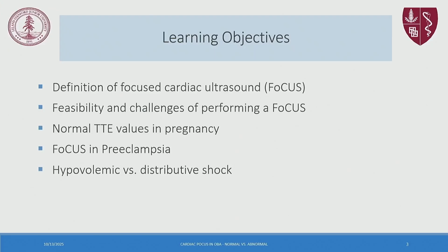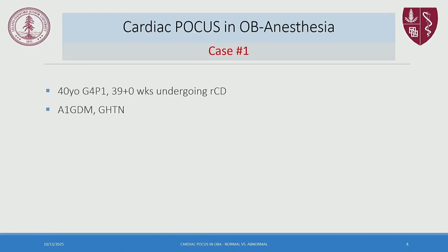I would like to cover first, when we speak about point of care ultrasound, what actually are we doing? The definition of focused cardiac ultrasound. What is the feasibility and what are our challenges when we perform a focused exam in pregnant patients? Then I want to go over what normal TTE values are in pregnancy. I also want to spend a few words on preeclampsia and also how we differentiate in this patient population between hypovolemic and distributive shock. And we start with a case, a routine case, a 40-year-old lady.